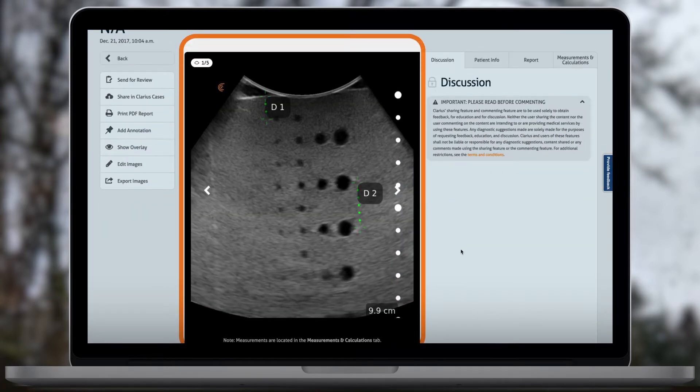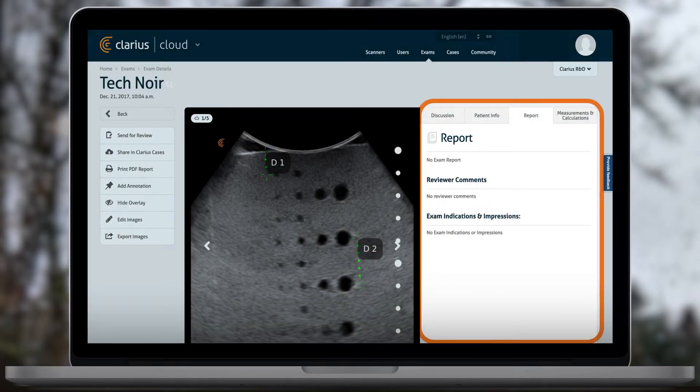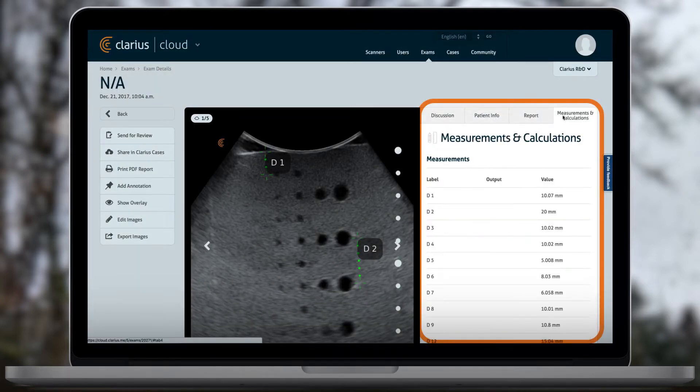On the right panel, you can see exam and patient information, reviewer comments, and measurements and calculations.